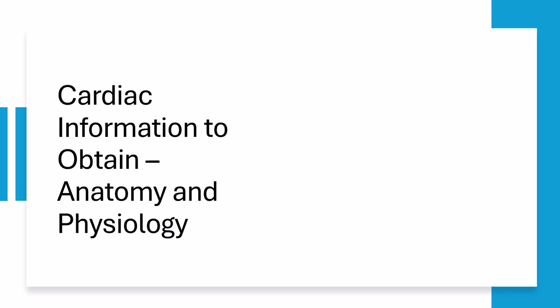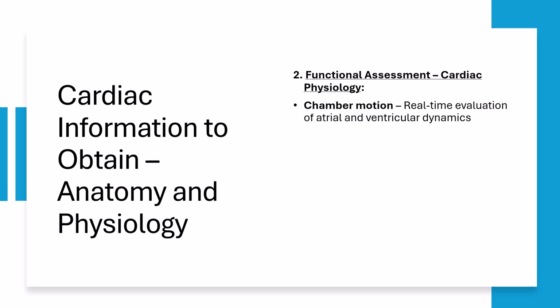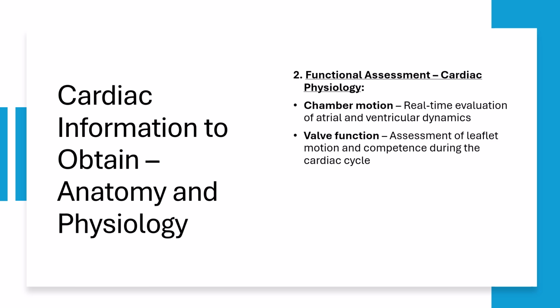Let's now turn our focus to the functional side of fetal cardiac assessment, because structure alone doesn't tell the whole story. With 5D Heart, we can observe chamber motion, capturing real-time dynamics of both atrial and ventricular walls to evaluate contractility, rhythm, and coordination. Valve function, analyzing leaflet mobility and closure throughout the cardiac cycle to assess valve competence and flow continuity.